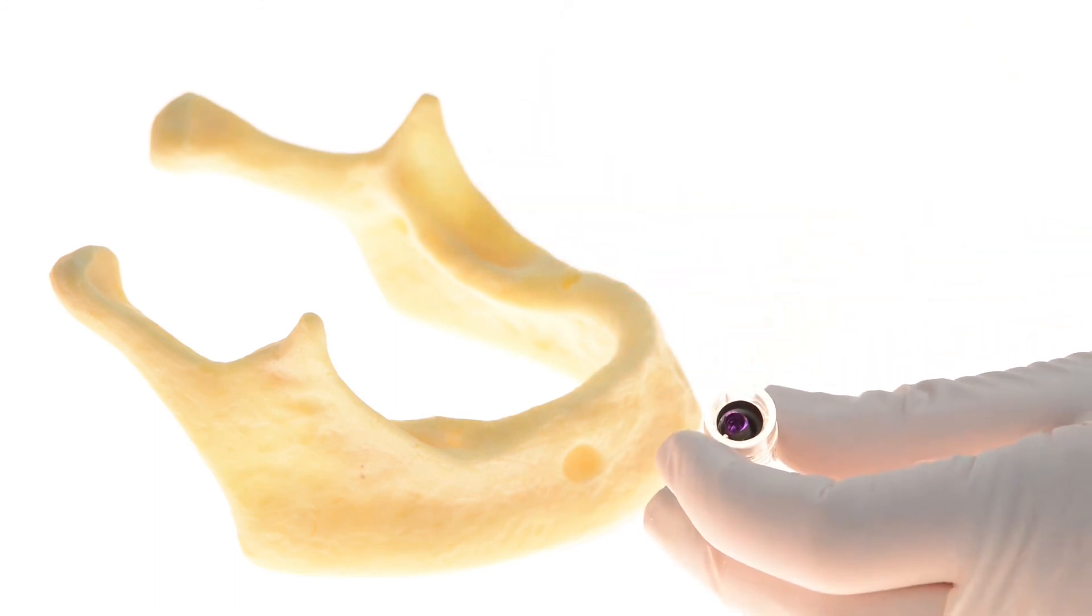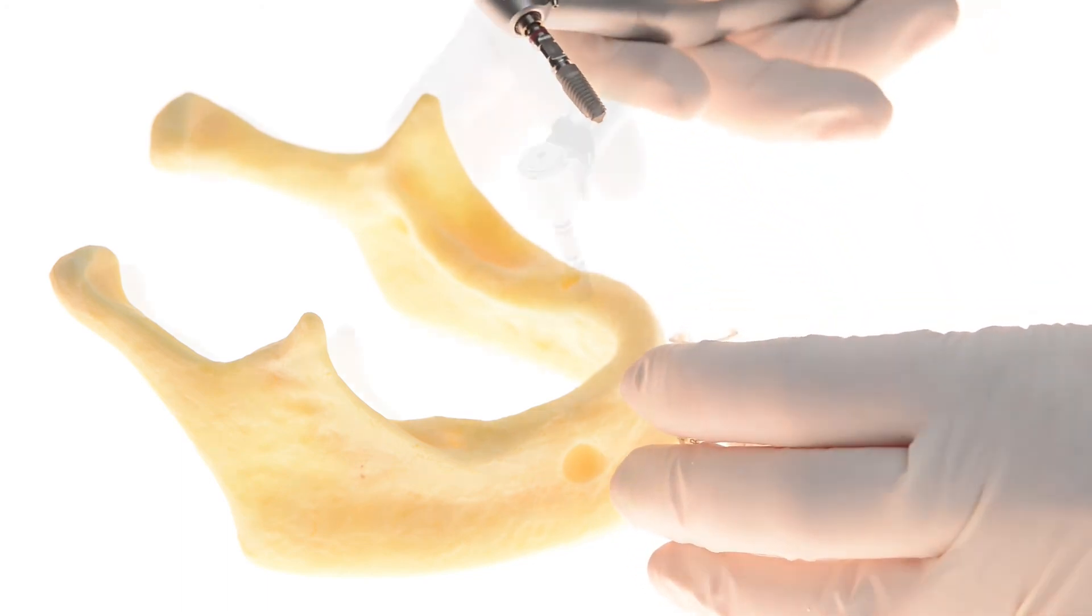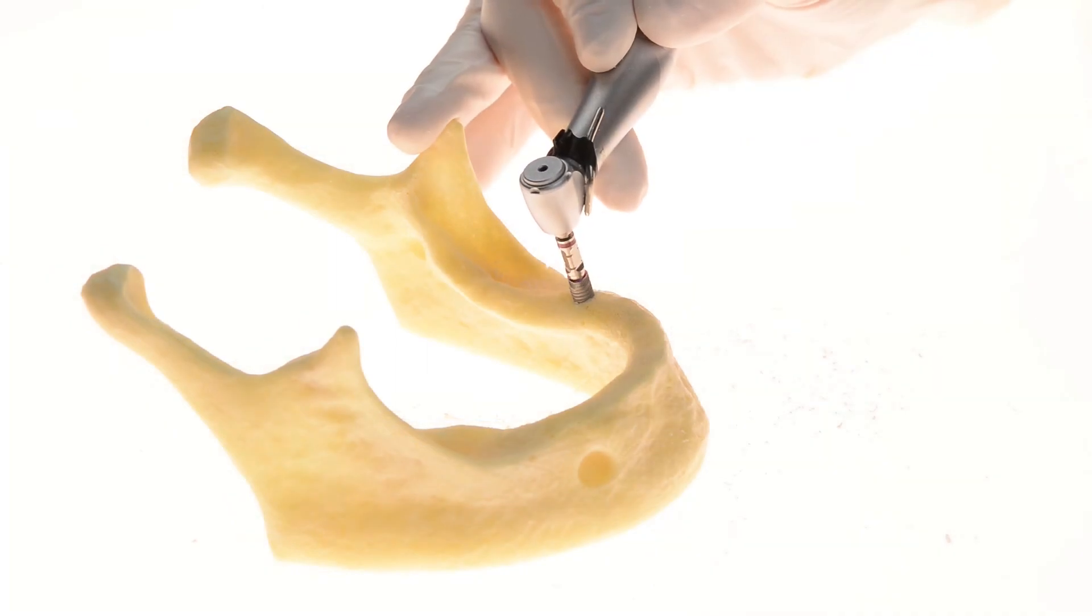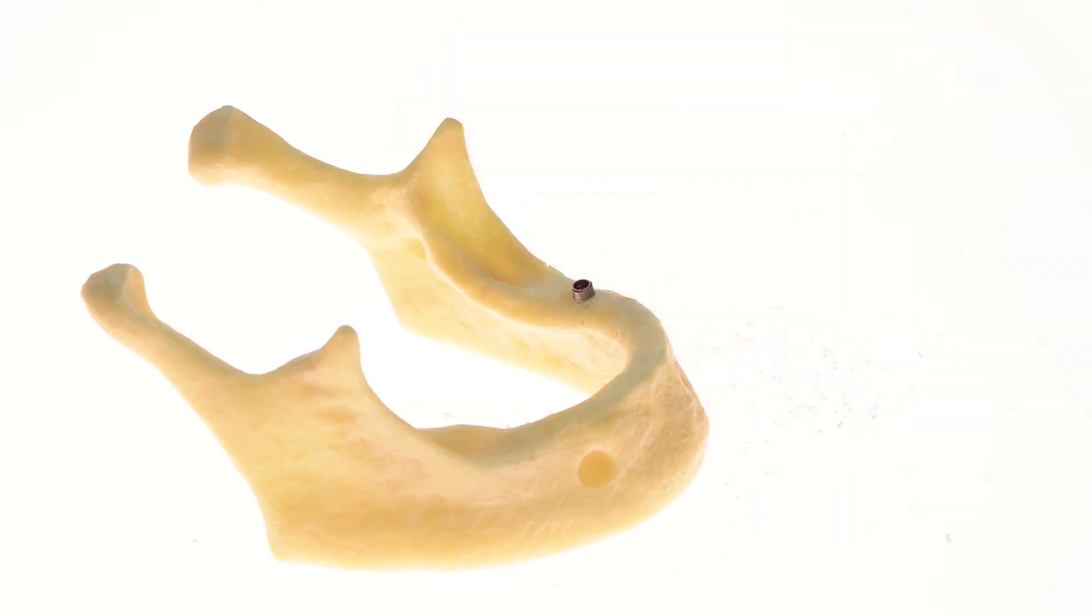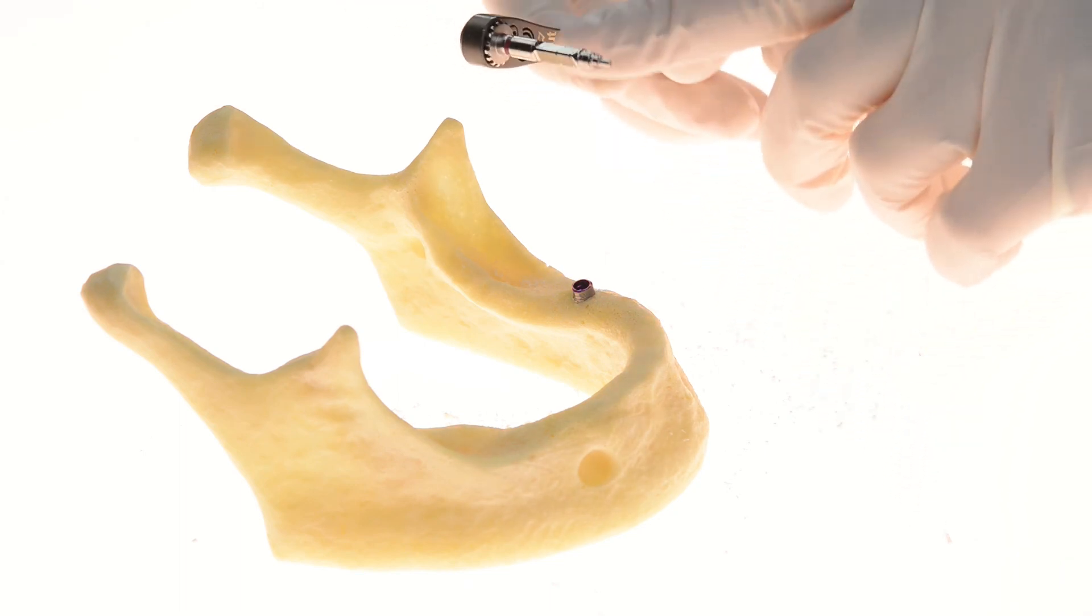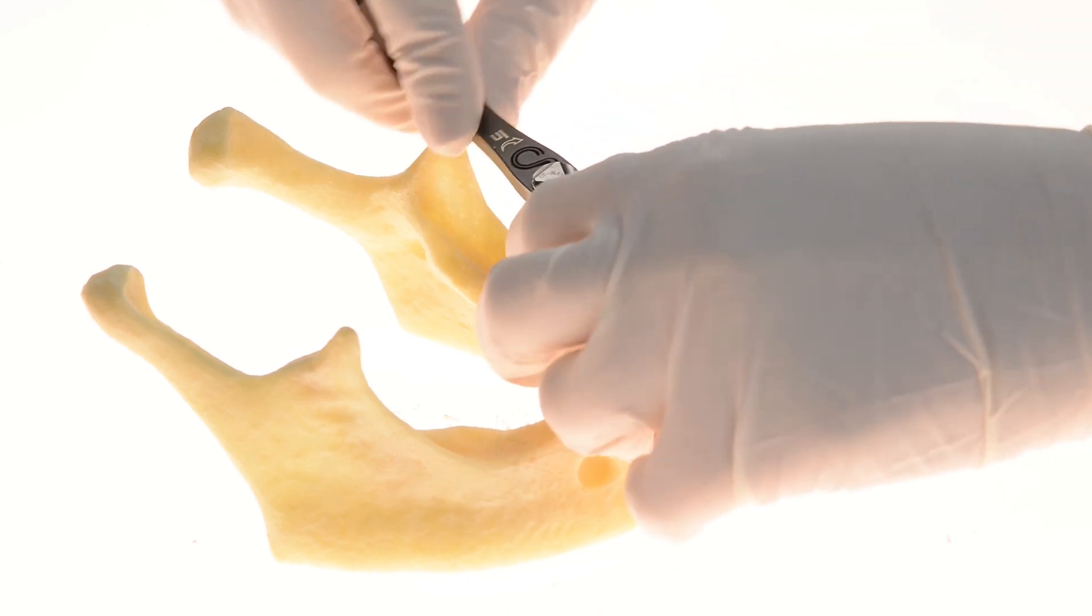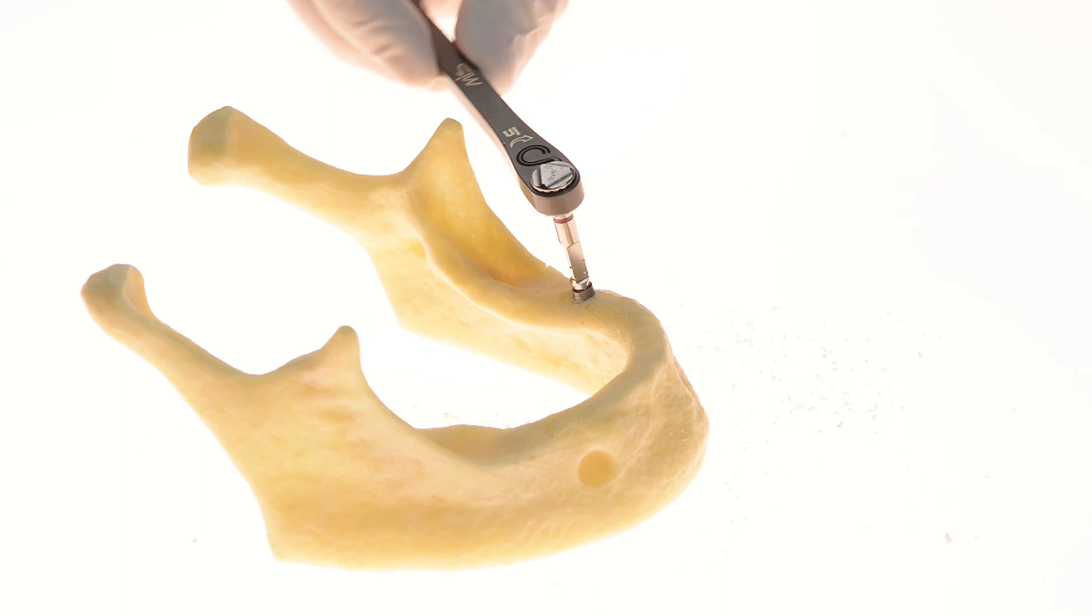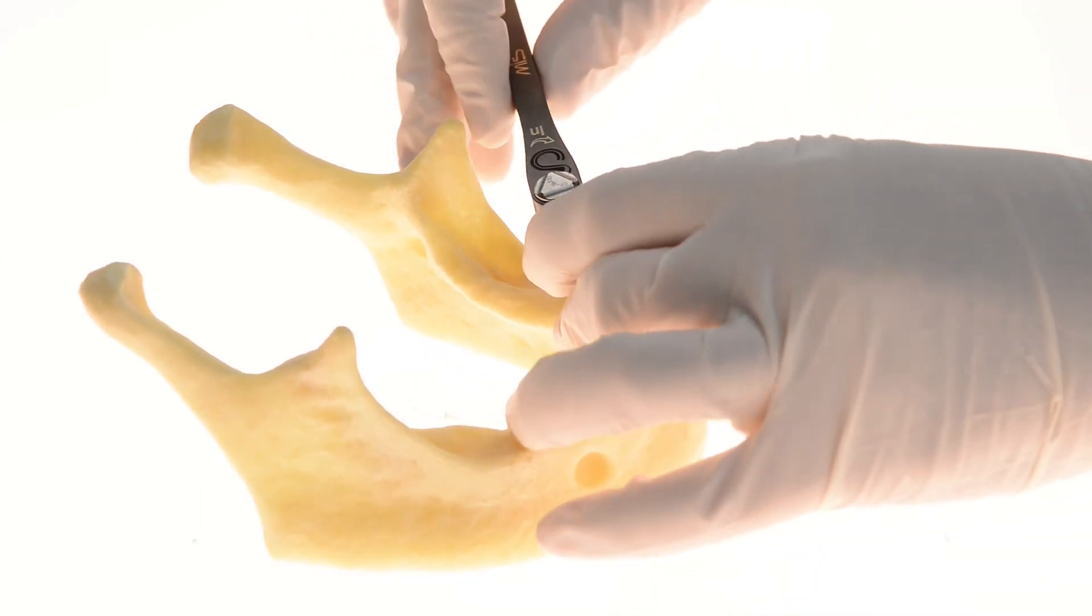Use the insertion tool to remove the implant from the sterile packaging. Place the flat wall towards the area where more room for bone and soft tissue is required. The ratchet insertion tool provides a top view of the triangle for perfect visibility.